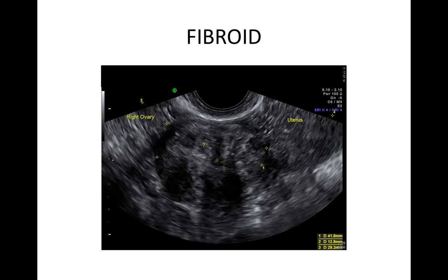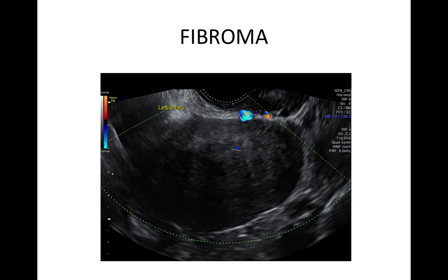This was a pedunculated fibroid. It is a regular solid mass with shadowing and minor vascularity. You need to look to see whether you can see the ovary separately and whether the mass moves separately from the uterus and ovary on pressure, and whether you can see a vascular connection between uterus and fibroid. A fibroma is a regular solid mass with some shadowing and minor vascularity, and can be mistaken for a fibroid.